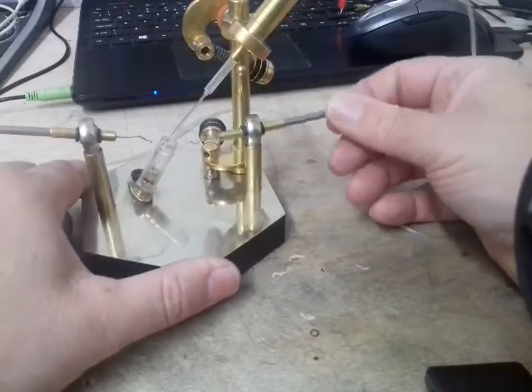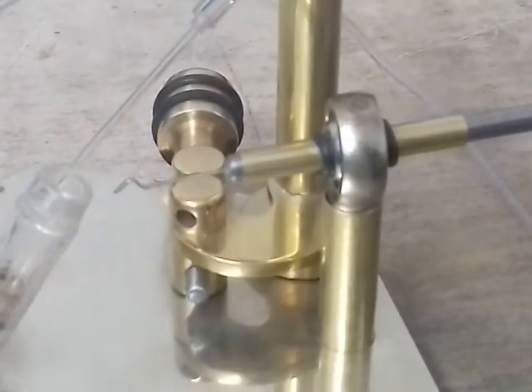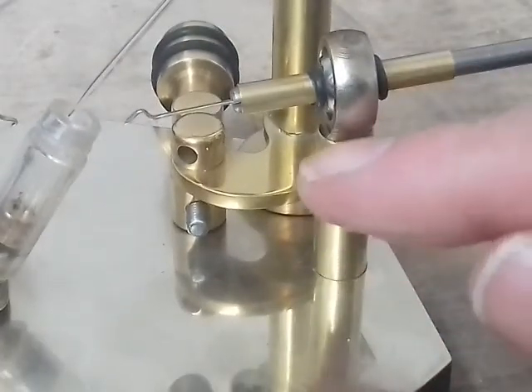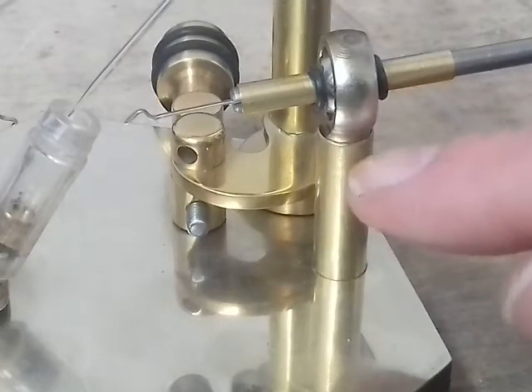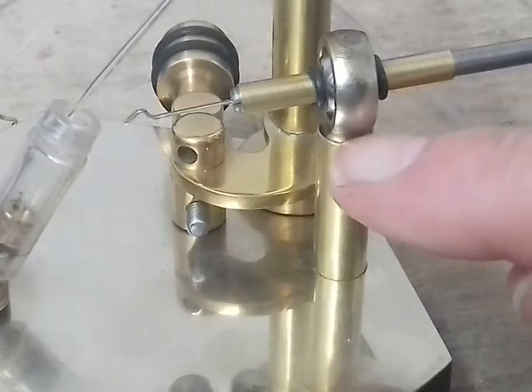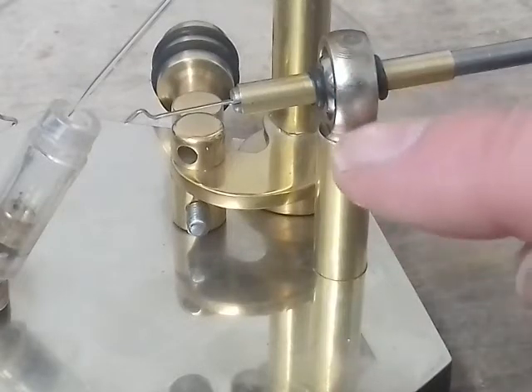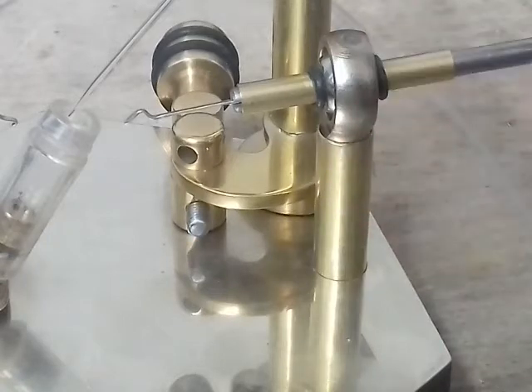And these ball bearings work so well. These ones are the slightly smaller 3/16 ones, and rather than go to the trouble of threading everything on and putting it onto a base, I've just used another piece of K&S tube, which turns out to be 5/16 inner, and these ball joints turned out to be almost the same size, nearly an interference fit, but just a little drop of super glue holds them in place.